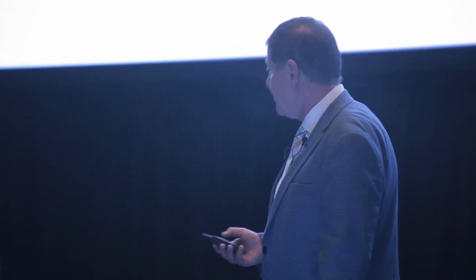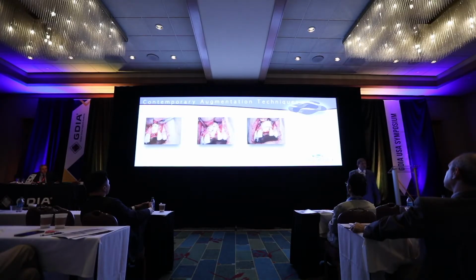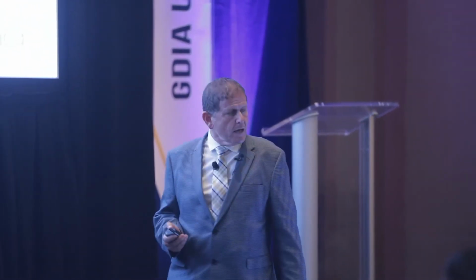Actually, up until now, we are working with granules and patties in order to improve handling. Those patties can be ones we purchase, or ones we make by ourselves. And of course, blocks, which are completely different techniques. So we are all familiar with those techniques. If we work with blocks, we need to shape and stabilize them. It needs some experience. If we work with granules, the same. We need to stabilize them in place to prevent their movement. Normally, we need to use membranes, which is an additional cost for us. And fairly, we can have some volumetric results.